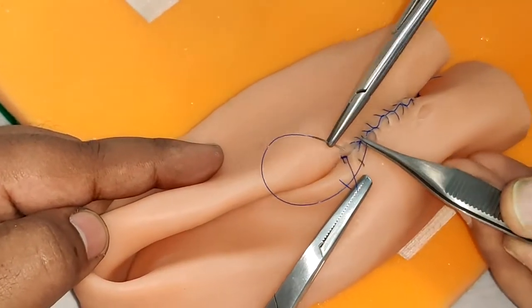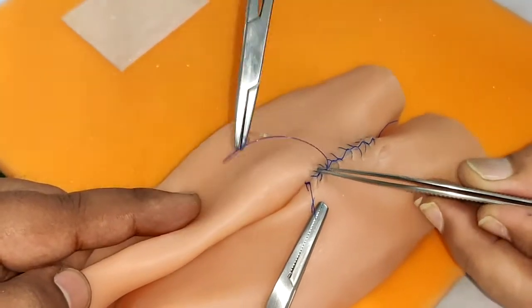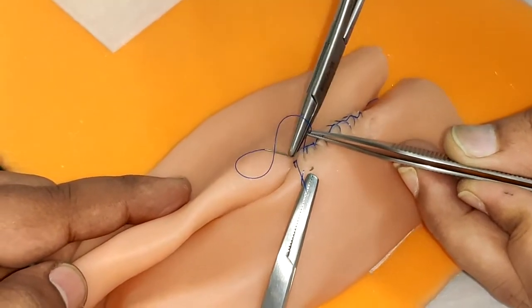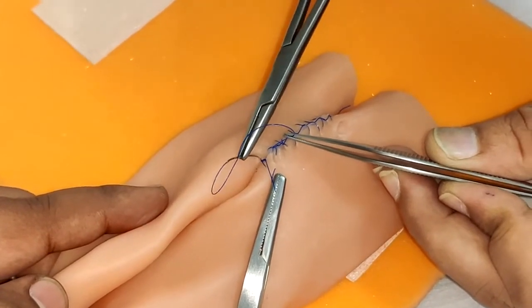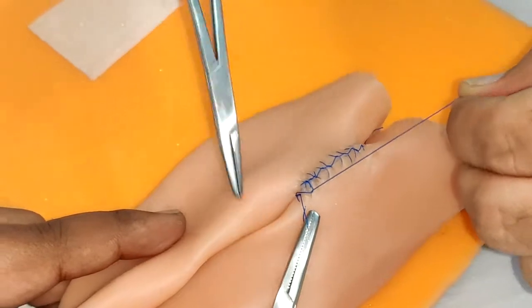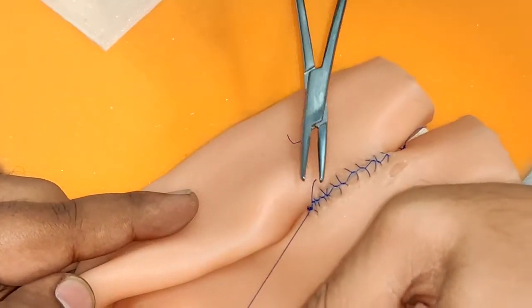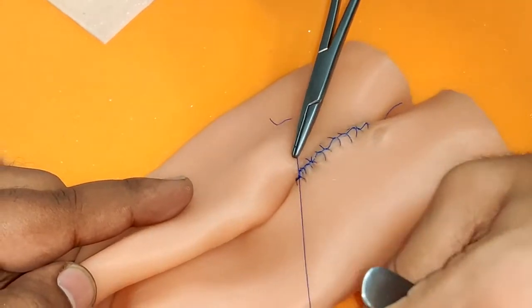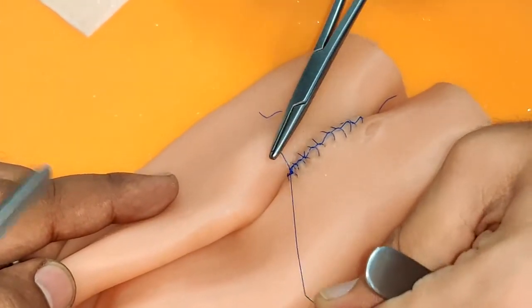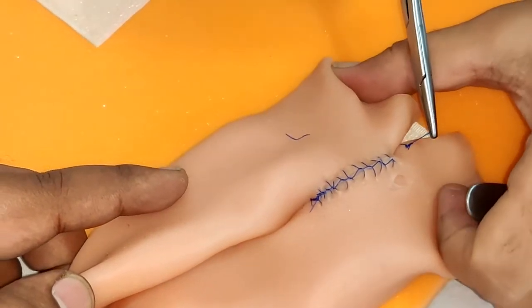We have almost finished. We will take one more suture beyond the edge to complete our side-to-side anastomosis. We will tie this end with the other free end and cut this free end as well.